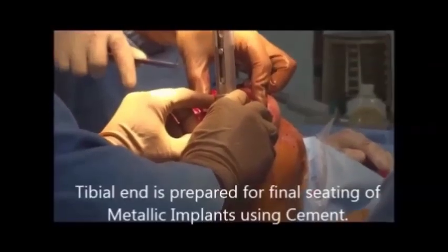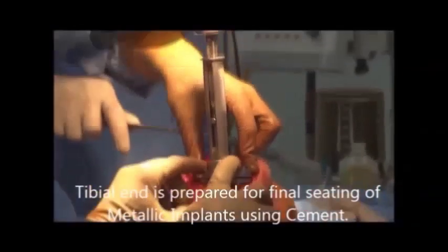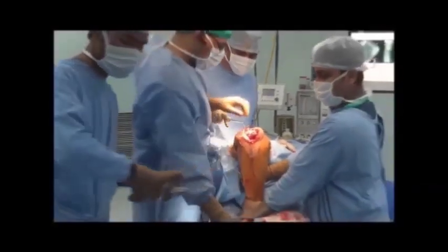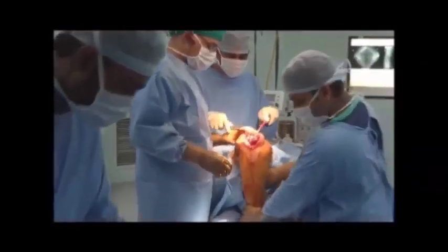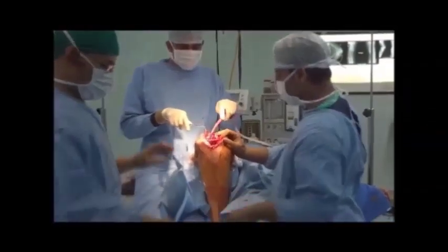After removing the painful knee joint surfaces, the trial implants are attached to the knee and the joint movements are checked and the size of the implants determined. Finally, the metallic components of the artificial knee joint are placed on the bone using bone cement in between.